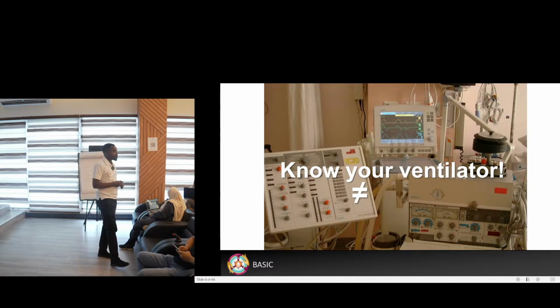So know your ventilators, know how they respond. Someone who is going to fix the ventilator needs to know how the ventilator is responding. Different ventilators differ with different modes and different settings. But you know your ventilator, so you know how it responds and you know how to put the settings right.